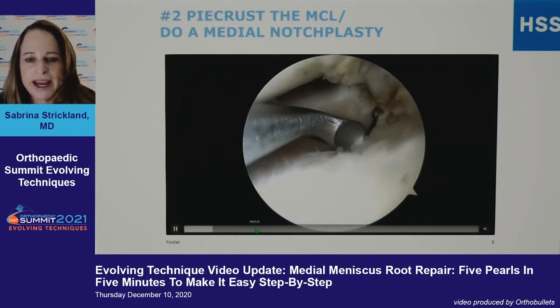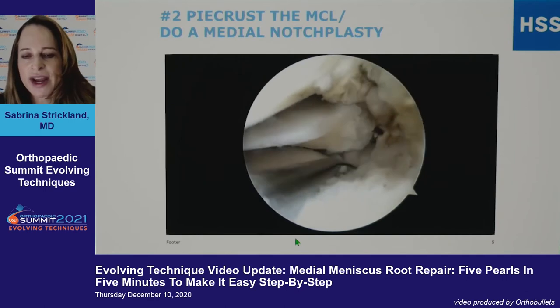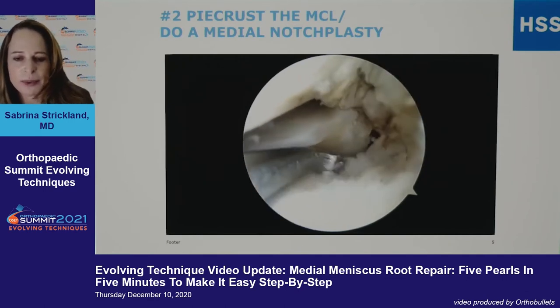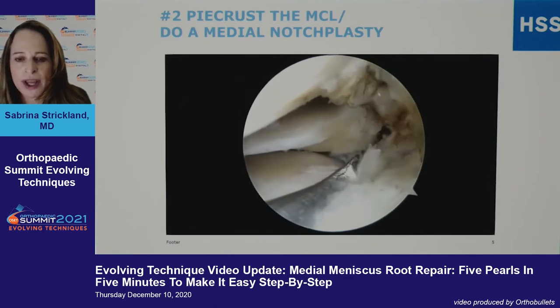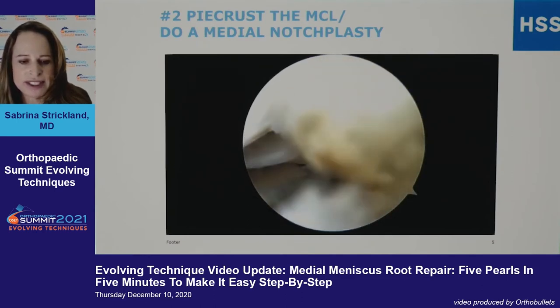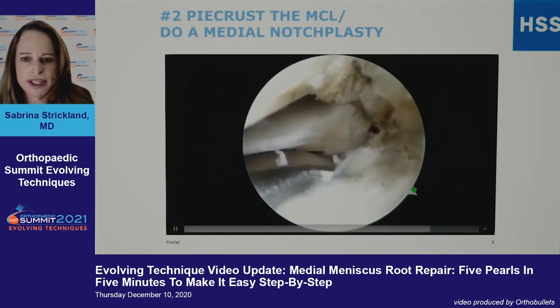Once you have a good view back there, you need a good surface to heal the meniscus to. Taking a curette — different companies have sets for root repair that come with a special curette, but any curved curette can work — you basically need to have a good bony surface to heal to, and you also want to be able to see the pin as you start drilling.